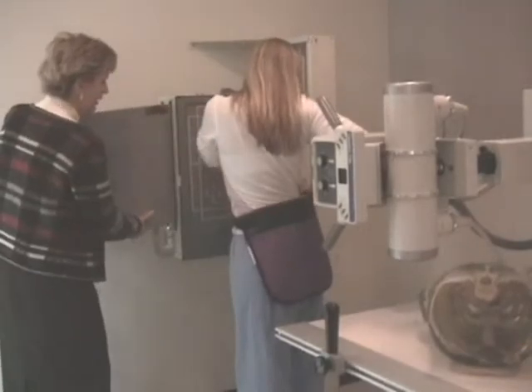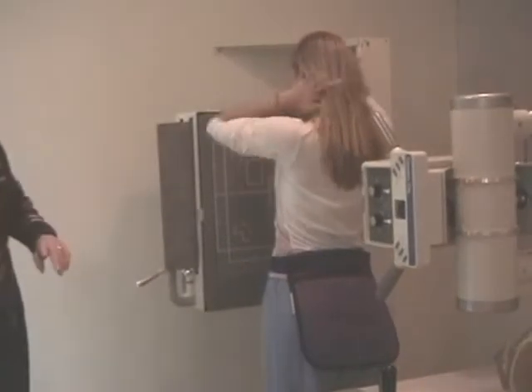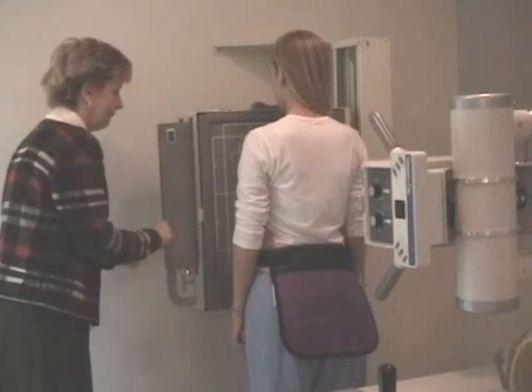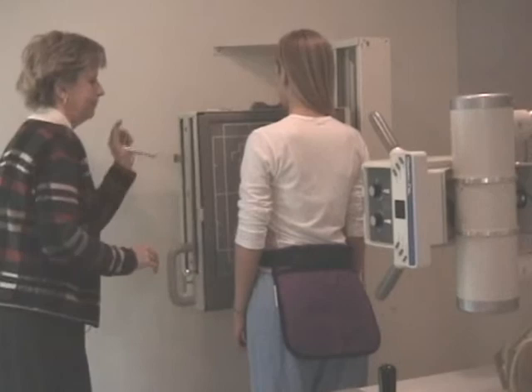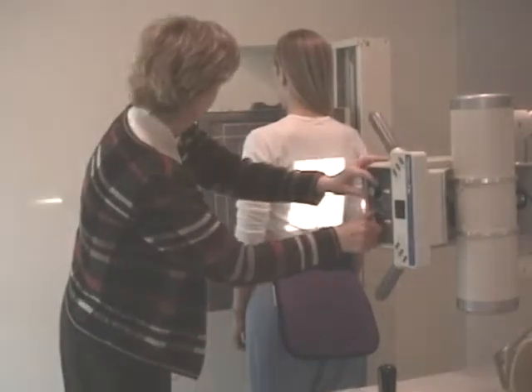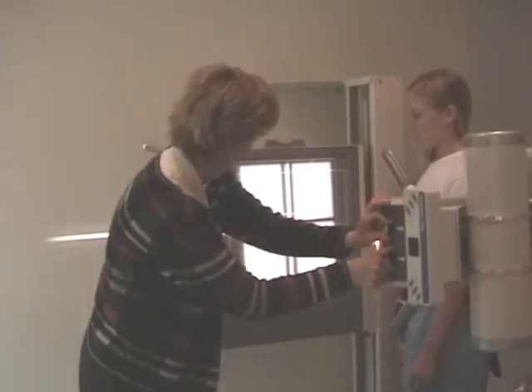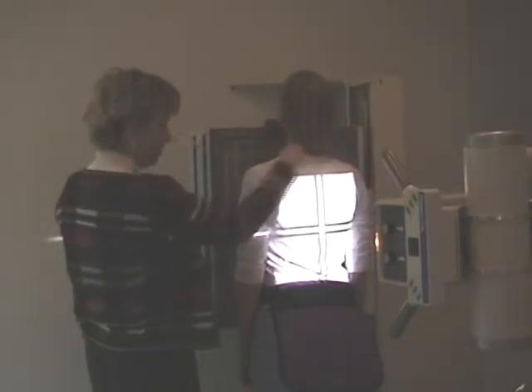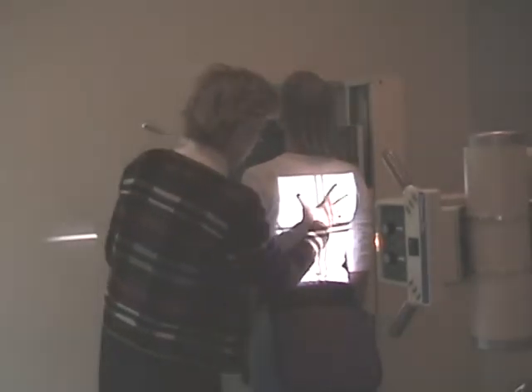We're going to set the scenario up for left anterior injury site. Left anterior injury site. ID to the top, L marker. Can you step away from the board for me, Kristen? 14 by 17 collimation. Okay. Elevate the board so the patient's chin's up on the rest, so you are 2 inches above the apices of the shoulder. Okay. Have them standing straight.